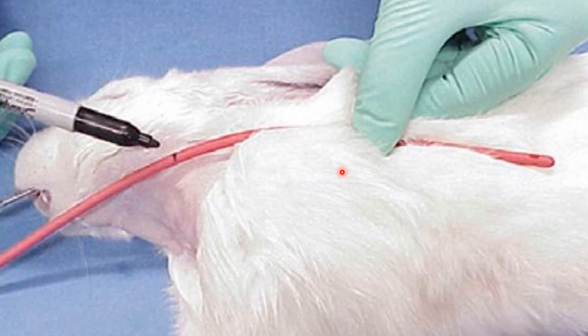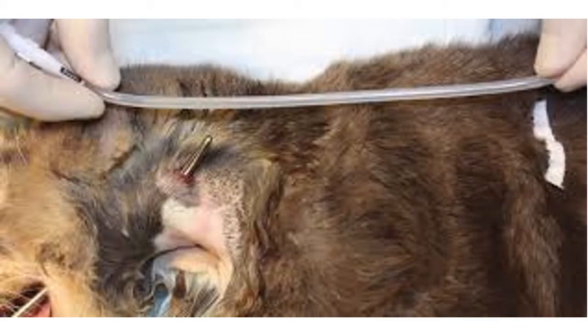So what can you do? You can have 2 pieces of these tubes. Mark 1, okay? You can mark 1 right here. Put that aside, put it on top of the patient right here. Then get your sterile tube and you will use these 2 as a guide to make sure that you have placed the tube in the right position.